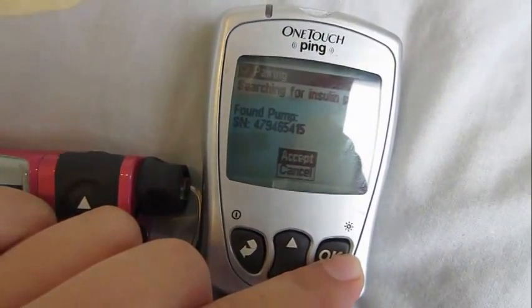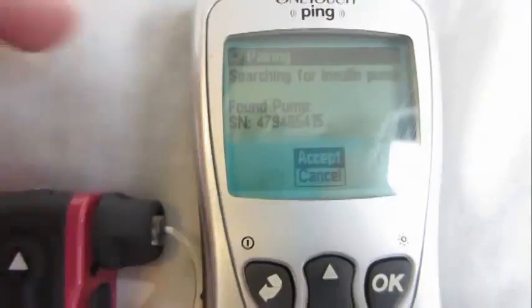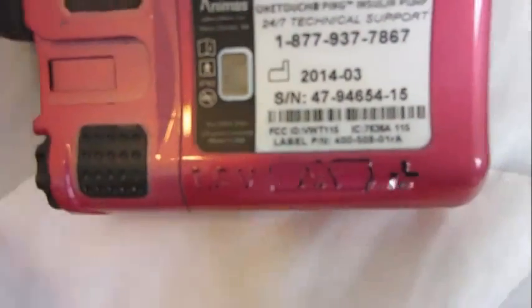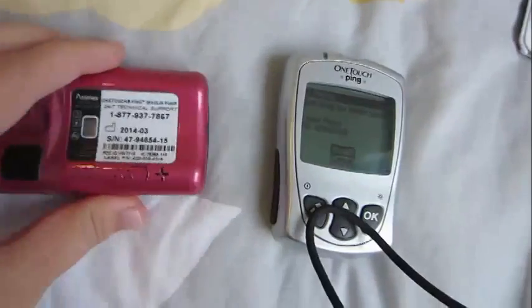They're both searching — and it found it. So it found this pump with this serial number, and what you want to do is just flip over your pump and check the serial number on the back to make sure it's the same. This probably seems really OCD to check the back of the pump, but what if this is the one time when you are near someone else who's pairing their Animas insulin pump at the same time, and it gets that pump? The odds of that are so minuscule, but I always check every time just to be sure. Maybe it could pair with another device.